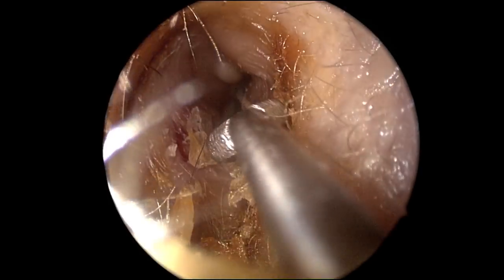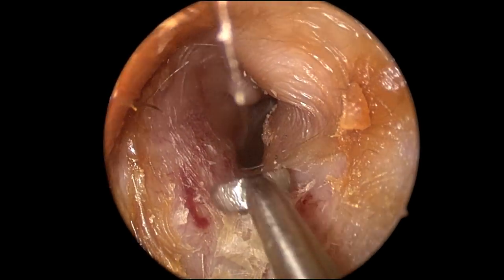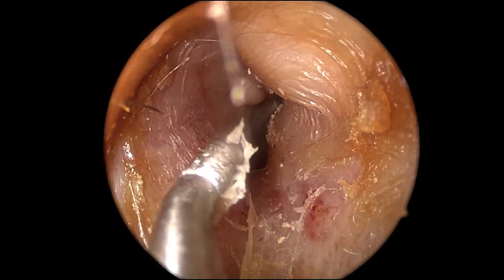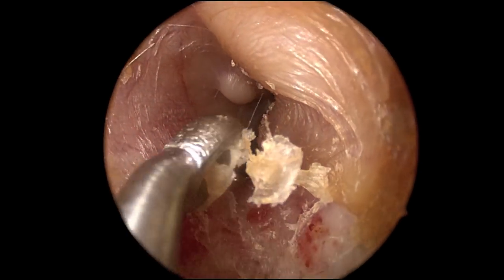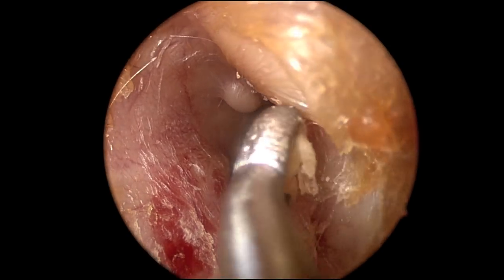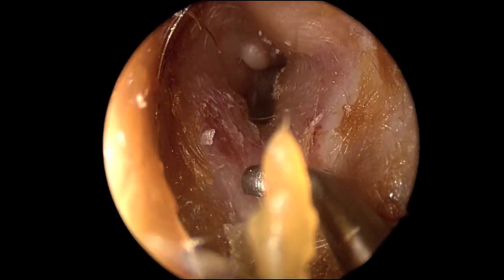Now we use a curette to gently remove some of the earwax lining the canal itself. Since the skin is very dry, one must be very careful as to not put too much pressure, which can cause irritation as well as discomfort.